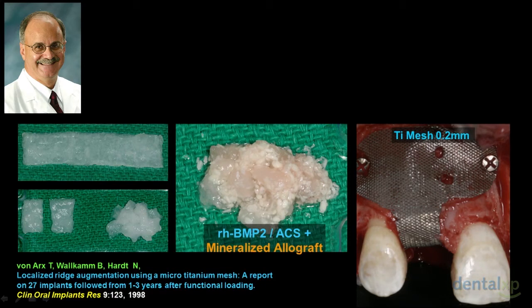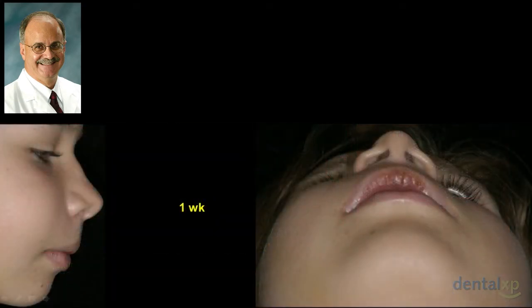I've used BMP in this particular protocol for some 5 years now. It works quite well. We also need some barrier, and here we're using titanium mesh, trying to get away from having to use materials that we have to re-enter and of course take out, especially in the aesthetic zone. But here we did use the titanium mesh.